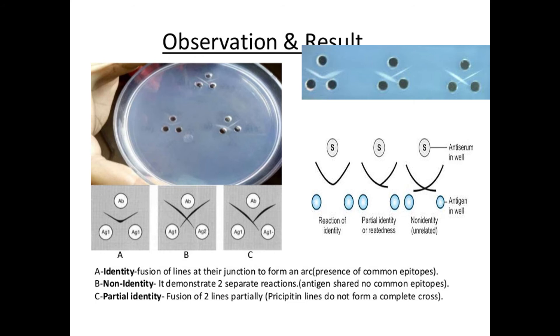After overnight incubation, take out the gel and observe for the precipitate lines between the antigen and antiserum wells by holding the glass plate to the light or against a dark background for contrast to visualize the bands better.